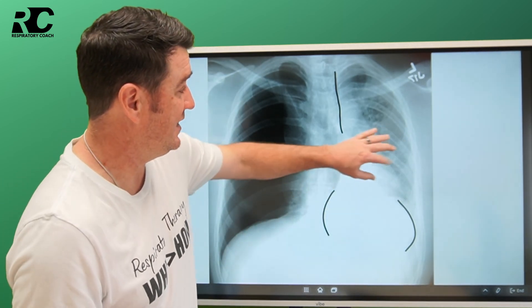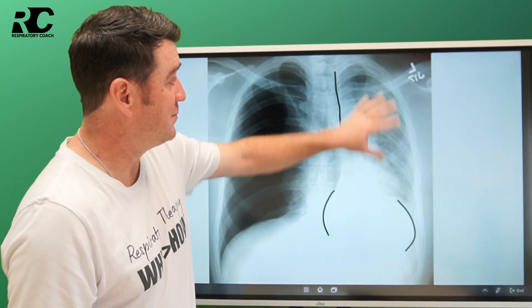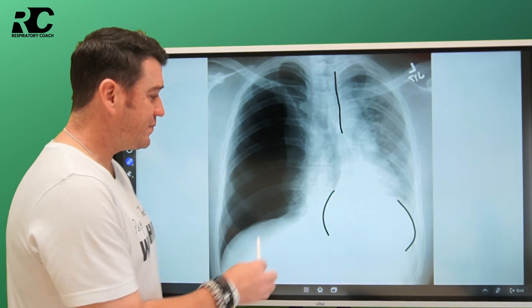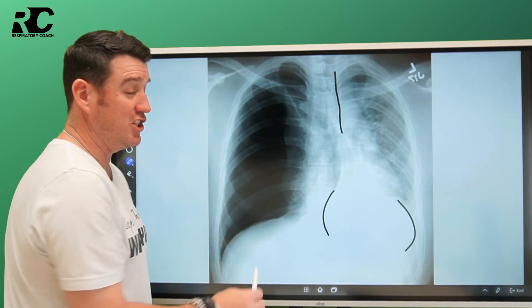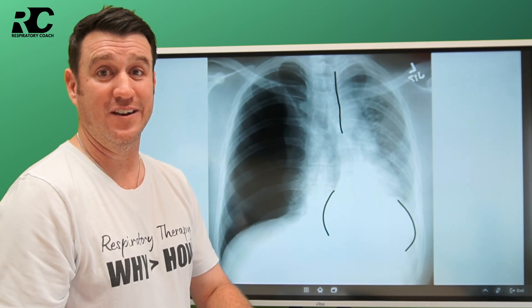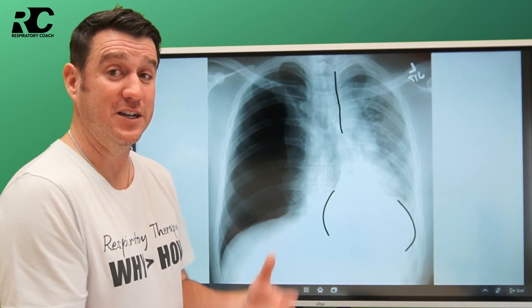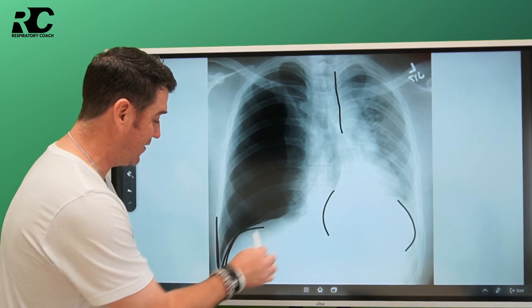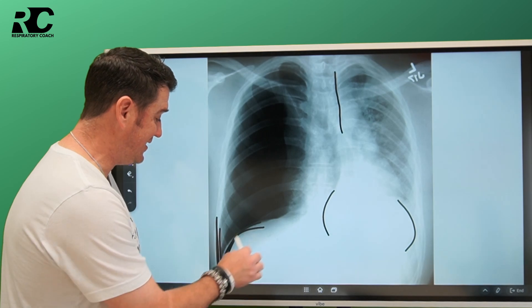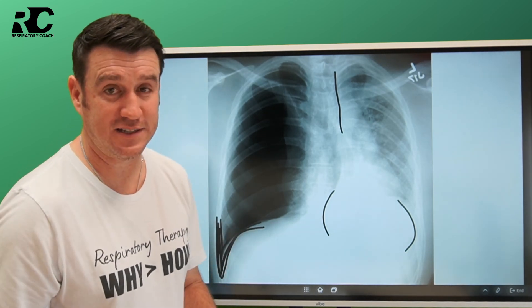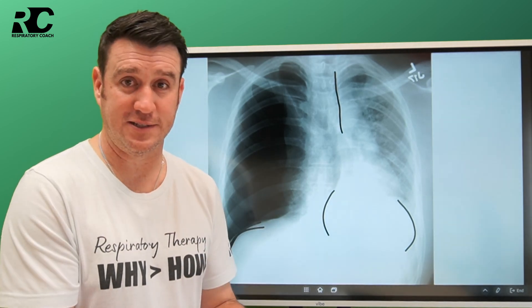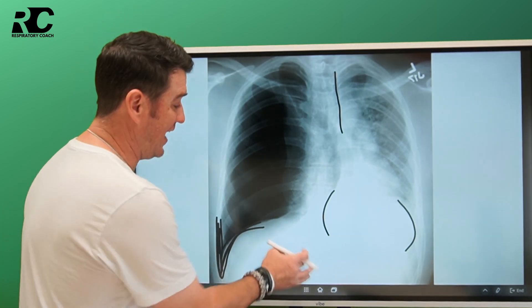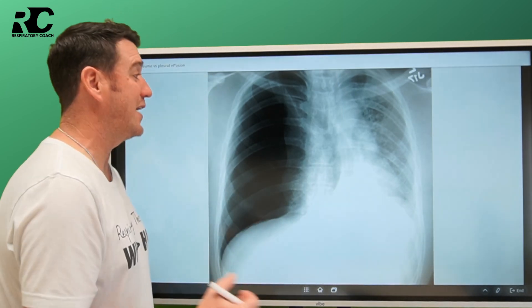I can see lung markings on the opaque side — they feather out to the thoracic edge. But on the hyperlucent side, I don't see any lung markings. It just looks very dark, very black, very hollow. I also see the costophrenic angle come way down here, and this is a telltale sign of this disease process, known as the deep sulcus. We'll come back to confirm what you thought it was.